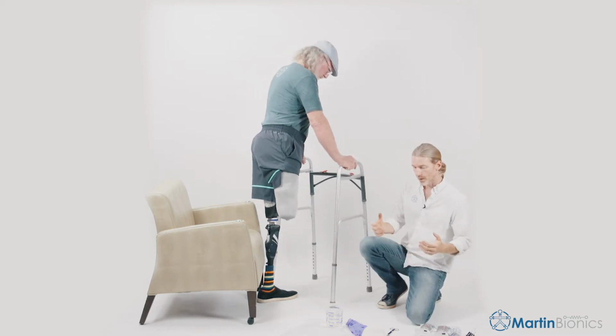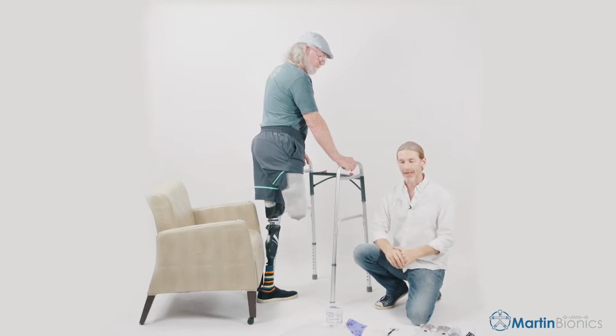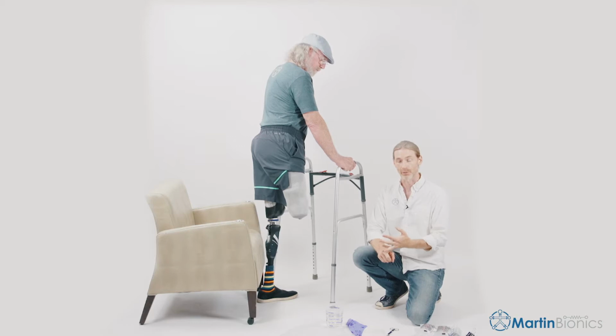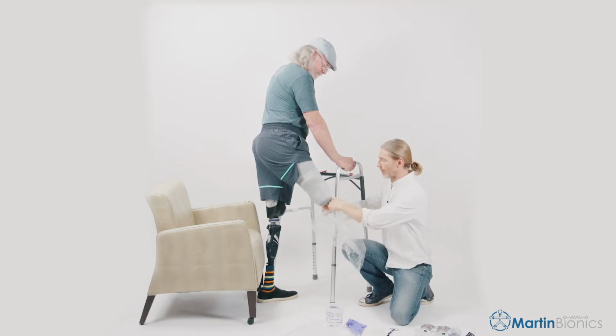We're going to make a cast of the distal half of the limb, and that cast is going to become functionally equivalent to our first check socket. So we don't need to modify and plaster, we don't need to iterate through check sockets. We're literally making our cast into our socket shape. So we're doing the full fitting in real time in a single appointment. So here we go. I'm going to start with putting a barrier over the patient's liner.